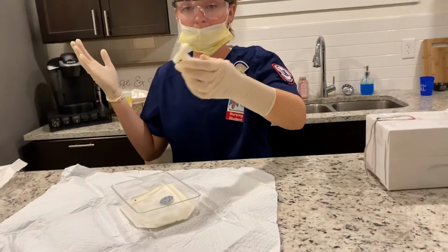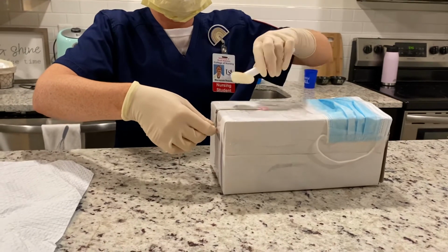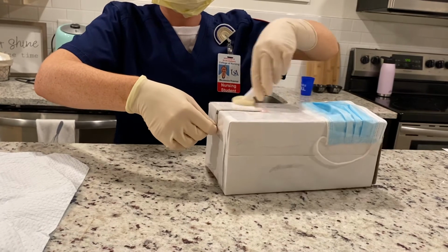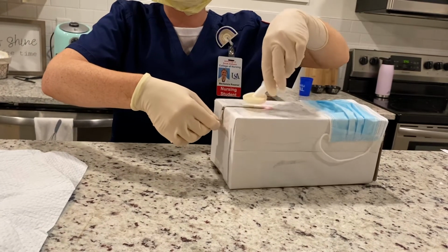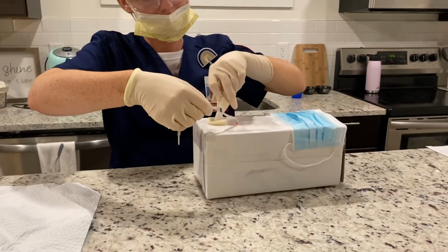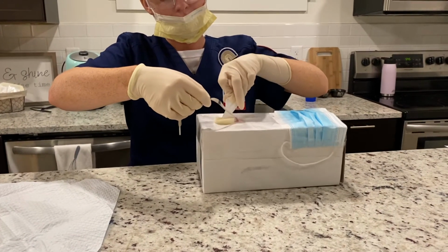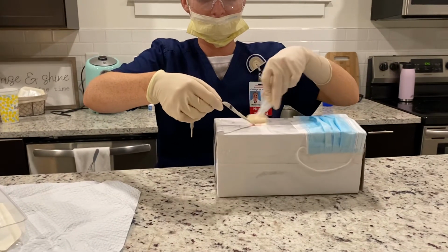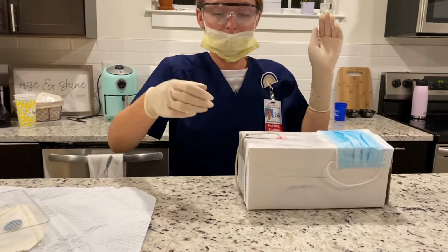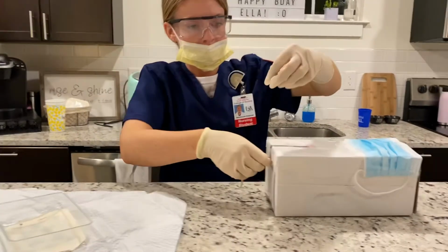And now I am going to get the ChloroPrep and activate it, and then I will use vigorous motions, horizontal and vertical, to clean, and I'll do this for 30 seconds, making sure that my sterile gloves do not touch the catheter or the patient's clothing. Okay, now I dispose of my waste. And now I'm going to apply the biopatch.